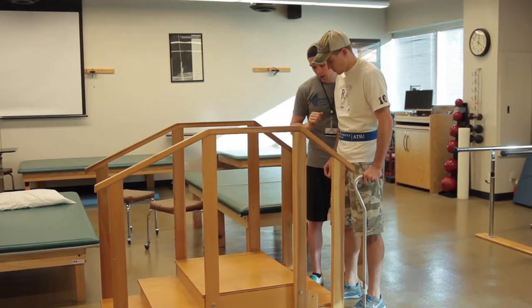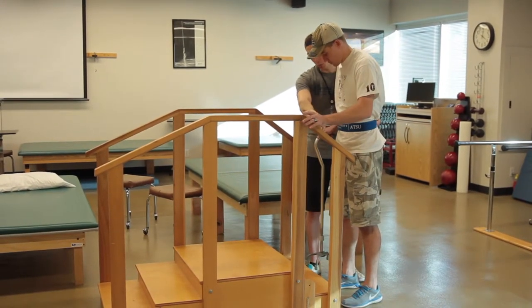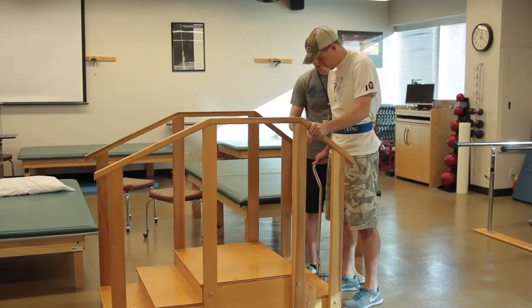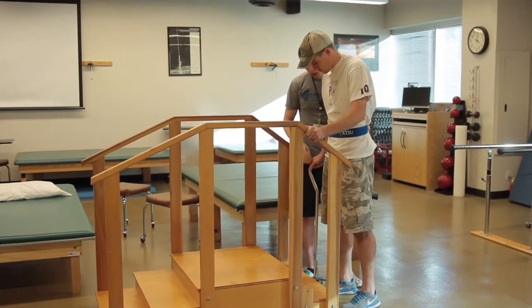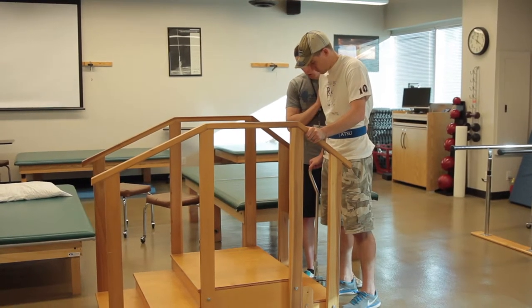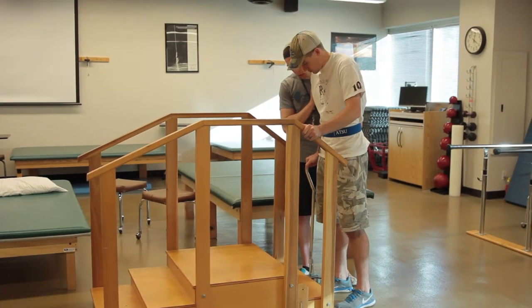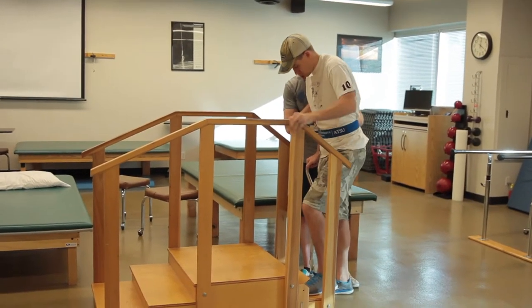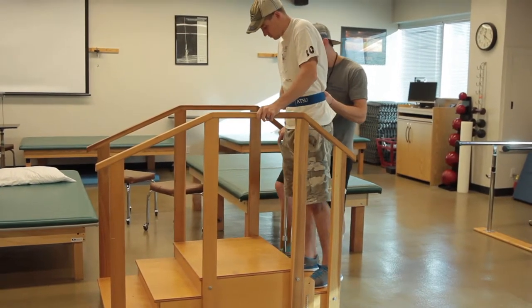So how this will work is you're going to switch the cane over to your right side because you're going to use that rail as your real stability. So that's where you want most of your weight to be going. You still obviously will have this. So I'm going to stay here behind you on the stairs, just right at your side behind you, making sure that we're all safe. So you'll go up first with that left leg, then you bring up the right and the cane. Good.